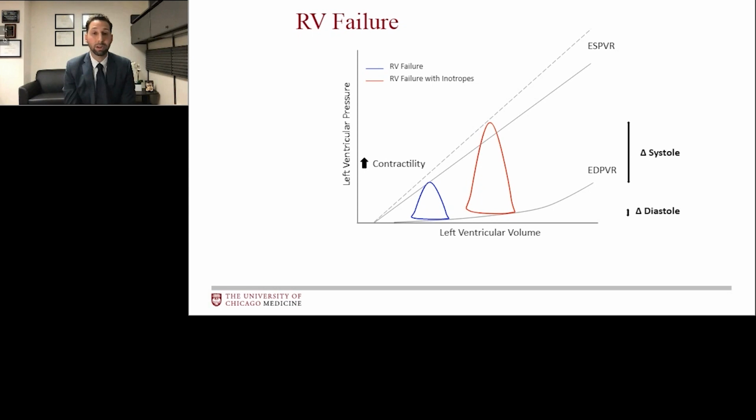So the net result here, if you look on the far right of the figure, is that diastolic pressure did increase modestly, but systolic, or at least peak systolic pressure, increased far greater. And again, diastolic flow will go up because of this rise in diastolic pressure, but systolic flow will increase more than diastolic flow, and flow pulsatility will widen.